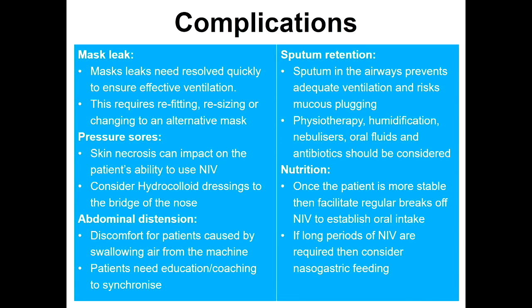Sometimes you need to resize the mask. Perhaps you've used the wrong size mask and you're not getting an effective seal. Or perhaps you need to remask, and that means considering a different or an alternative interface, such as a total face mask or a different style full face mask. We would ask that you discuss with your local respiratory specialist should you be having mask issues or problems.